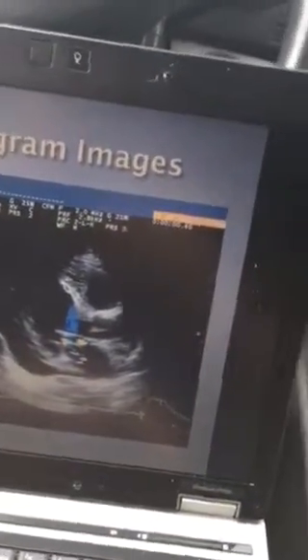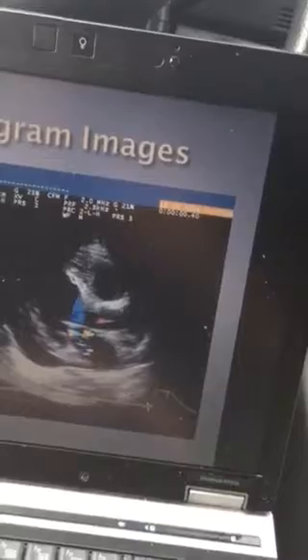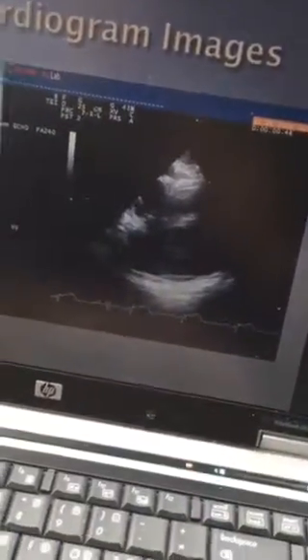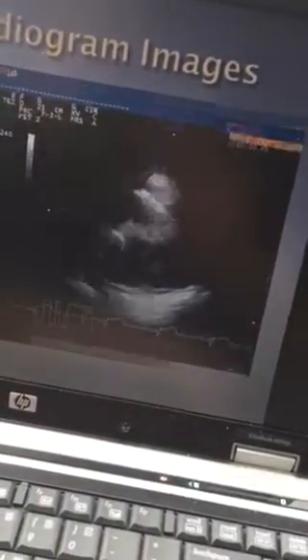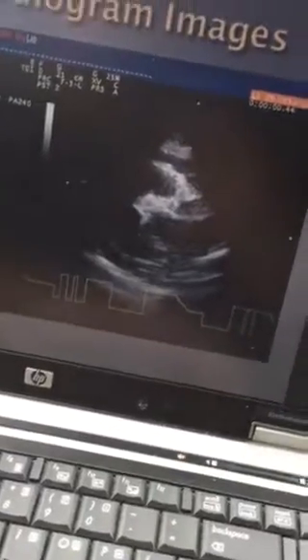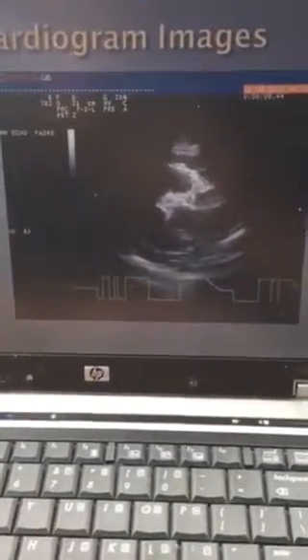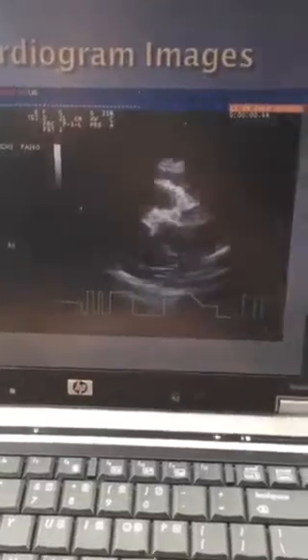When we put color on the parasternal long axis, we can see a little moderate mitral insufficiency or mitral regurg. That should be mitral regurg, not MI. Here are parasternal short axis views, starting with the apex, then going to the papillary level, which we see there. Mitral valve is a very limited view, but it does show that mitral function. We can see the aortic valve is trileaflet. The short axis view also gives you partial view of the tricuspid and pulmonary valves.